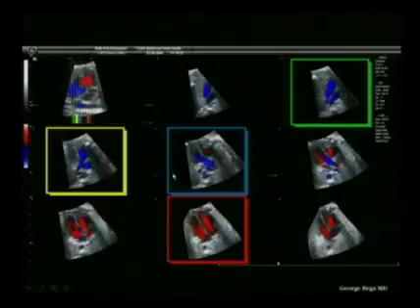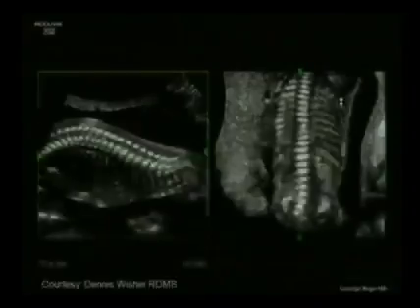This is the level of the bifurcation of the bronchi and the carina level. This is an LVOT, and this is a 4-chamber view. So basically, from the 4-chamber view, you're going up, and you start picking up the LVOT, then the RVOT, and then the roof of both pulmonary and the aorta. That's the so-called 3VT view, or the trachea view.